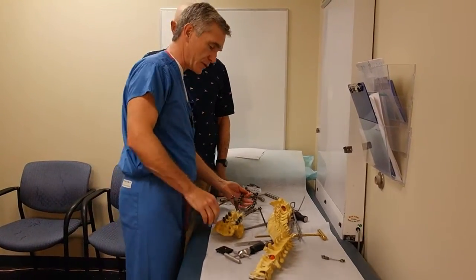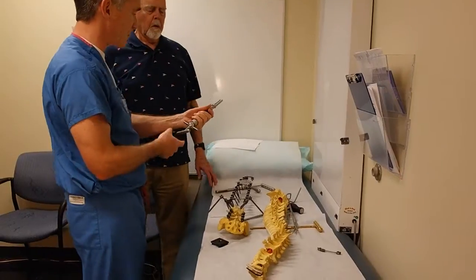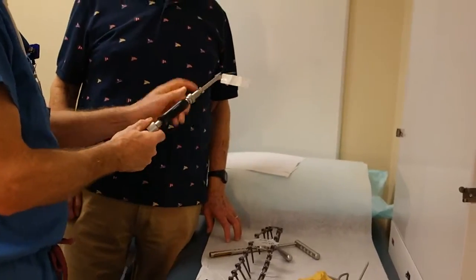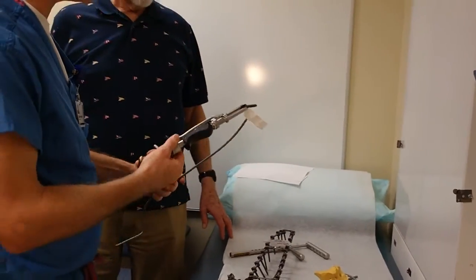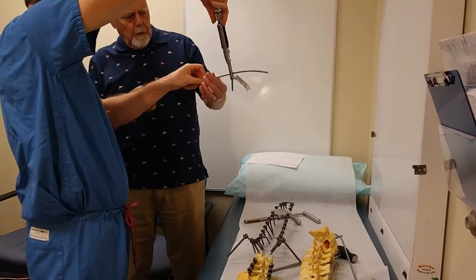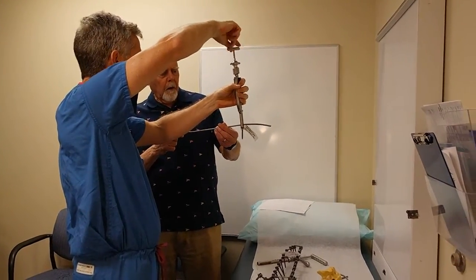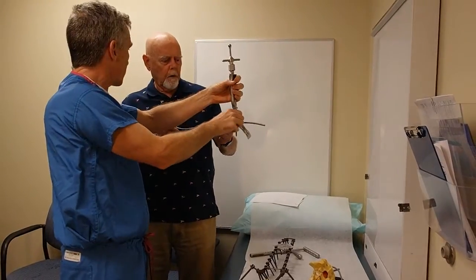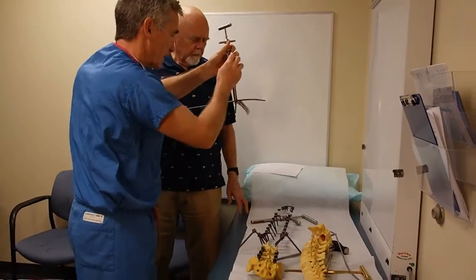Then we actually insert the rods into the screws using this device. This is called a persuader, and it clamps onto the screw at each level. There's a little cap that goes inside there, and the rod is sitting off the spine. This is going into the spine like that, and this is the rod. At each level I can screw this thing down like a corkscrew — see how it pushes the rod down into position. If I had a cap on there, it would lock the cap in. Then I can take this thing off, and the cap would be in place.